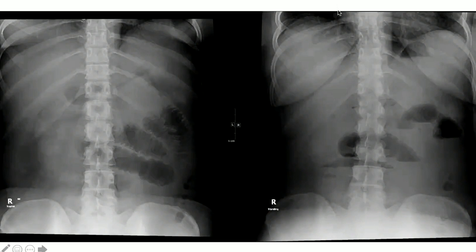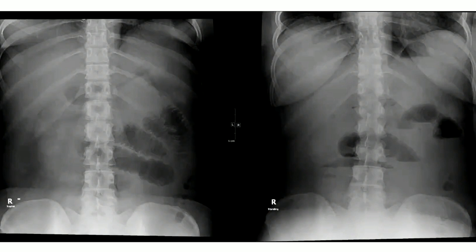Based on these findings, my diagnosis is small bowel obstruction without any pneumoperitoneum. I would like to do a CT scan abdomen with contrast for further evaluation of this patient.